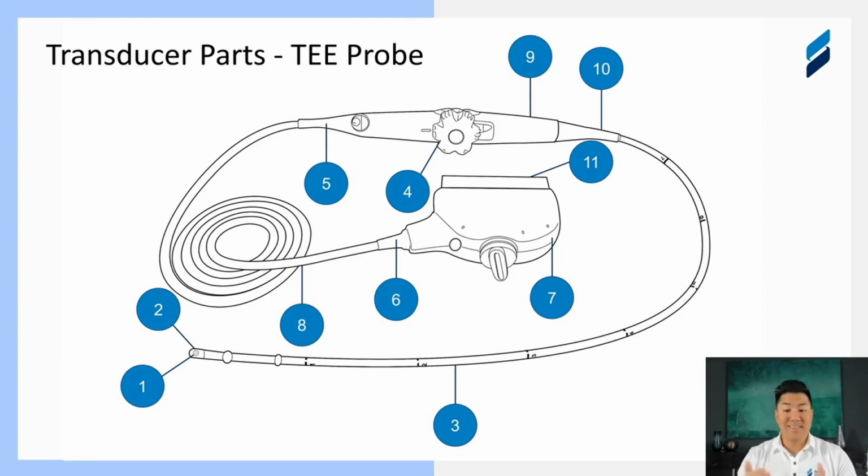They're in the esophagus, in stomach acid, so there's an acidic chemical environment. They're around a lot of surgical equipment, so they're prone to getting stabbed and cut, things that could expose the internal electronics. That's bad for the patient, number one, but also bad for the electronics, number two. And on top of that, when they're getting decontaminated, they're sitting in caustic acid again.